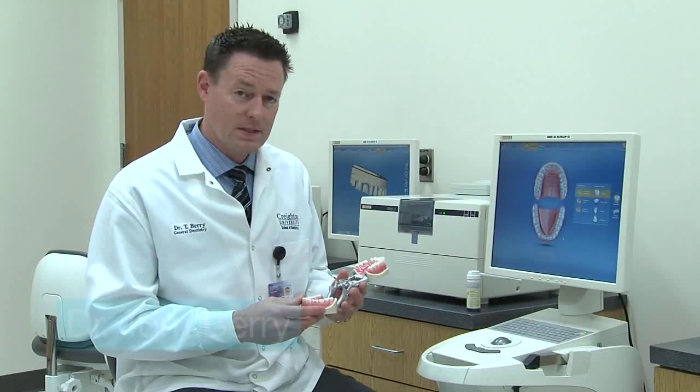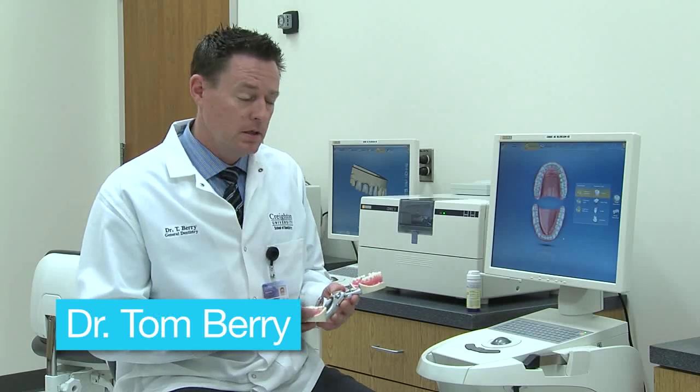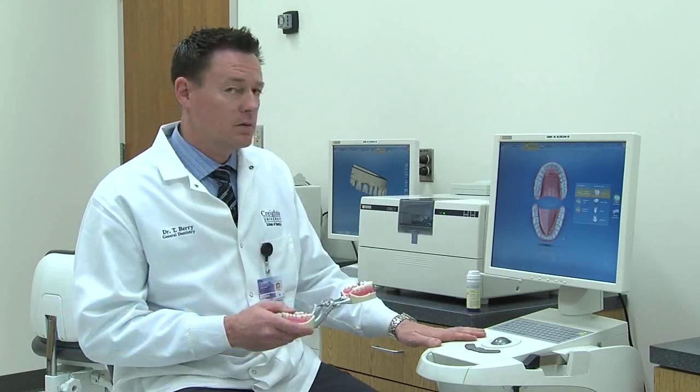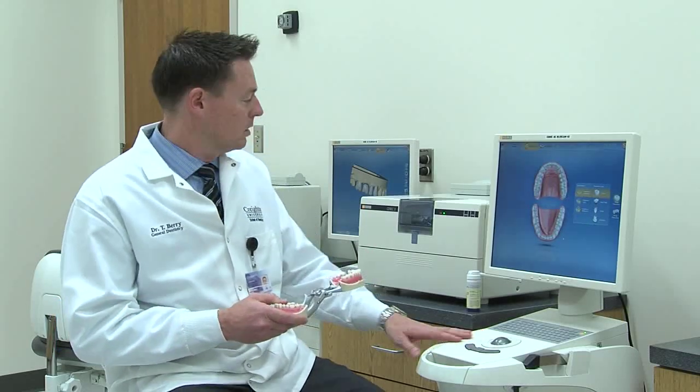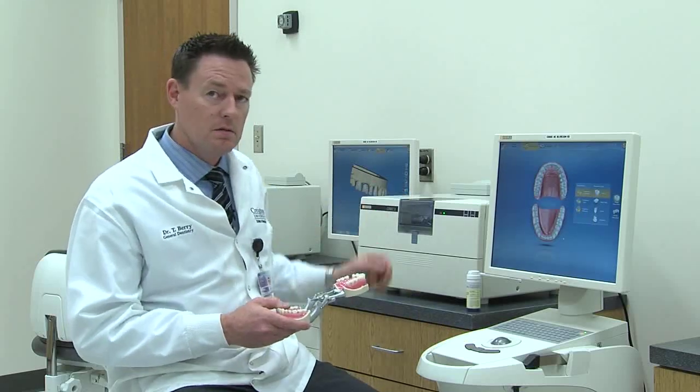Today we're going to be designing and milling a crown for tooth number 19 on our patient, using the CEREC Acquisition Center and our CEREC milling unit, both by the Sirona Corporation.